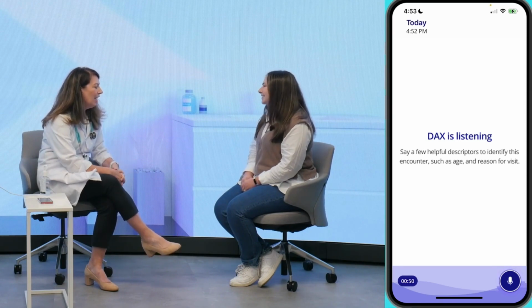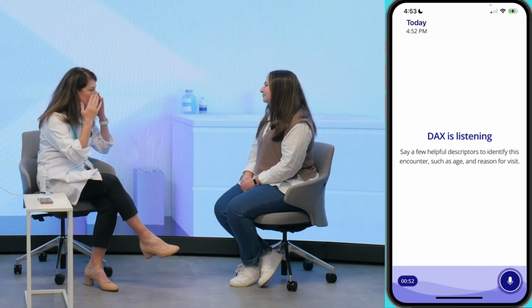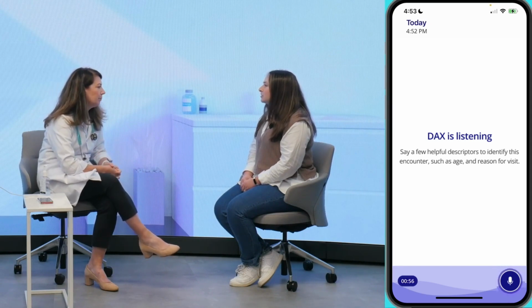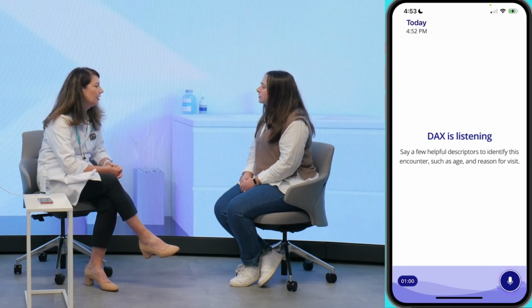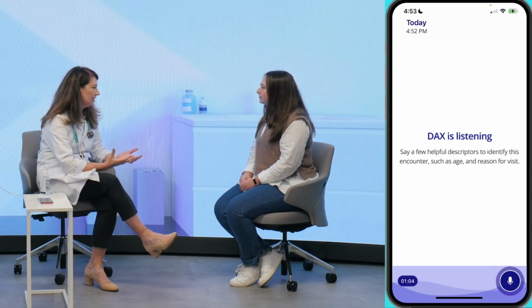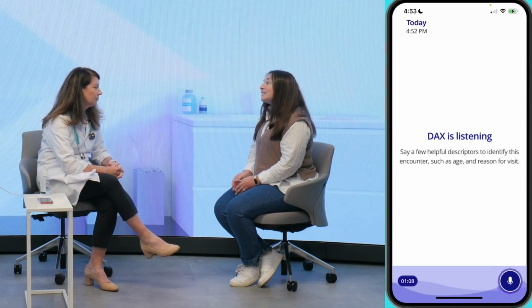Yeah. And any pain in your face at all? Any nasal congestion, sore throat, anything like that? Just the sore throat. I haven't noticed any nasal congestion. Okay. And then can you think of anything that might have caused this? Is anyone else sick? So I went on my friend's bachelorette trip 2 weeks ago, and one of the girls came sick. Okay. All right.